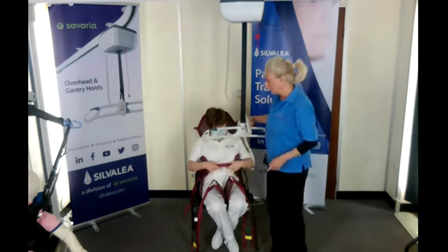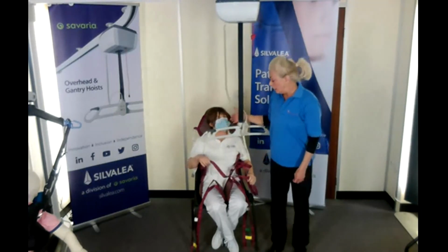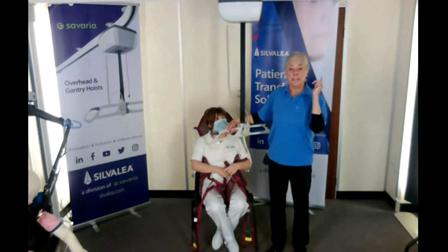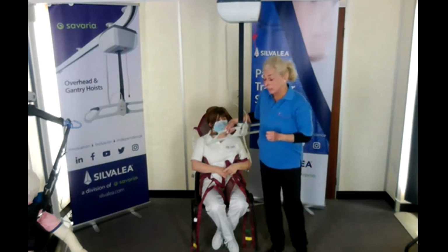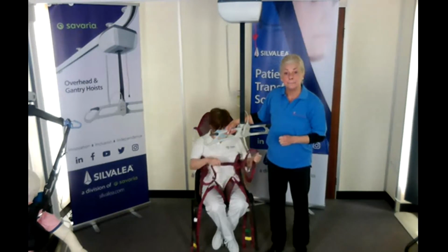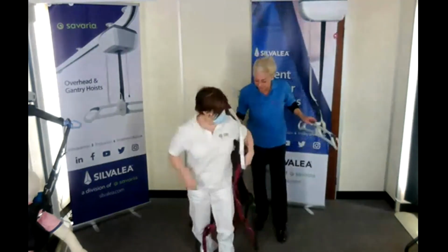And then the other query we have is, Leslie has a child who holds sling straps and thrusts backwards. Is this possible in this sling? They can hold the straps. That's fine. They can hold the leg straps. If they thrust back, the counterbalance will allow that movement. If you want to restrict that, then we need to look at a different style, which I'll show you. We have got another option, but certainly this will allow the movement. That's everything. Okay, excellent. Thank you.